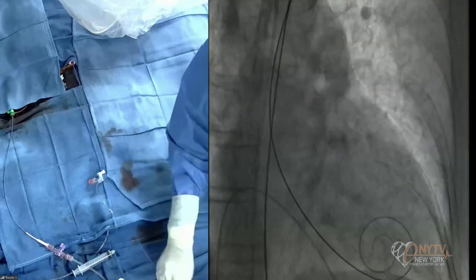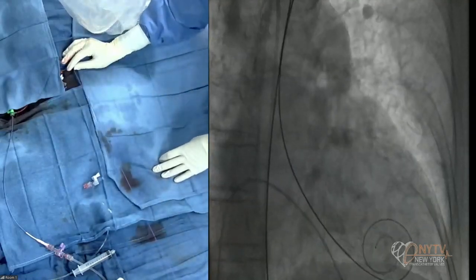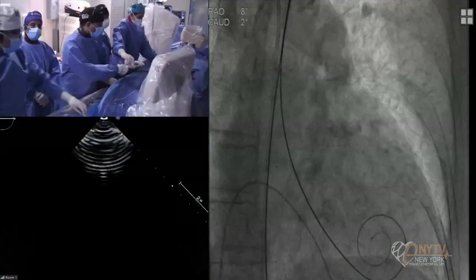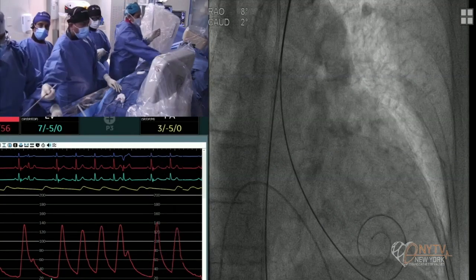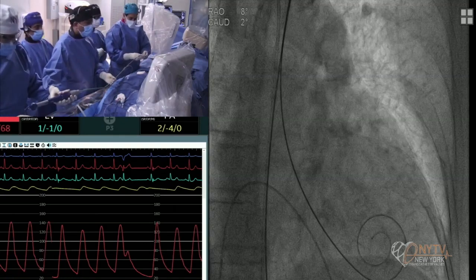And please keep showing the hemodynamics on one side of the screen. Yeah, that would be great. We don't need to see the axis. Instead of the axis, give us the hemodynamics on the left side, please. So we're just getting the valve now. We're not going to pre-dilate here because there's not much calcium, mixed picture, but we might post-dilate if the valve looks underexpanded on the fluoro.